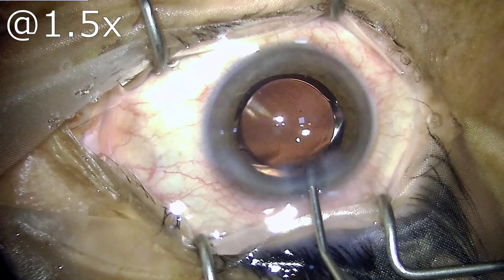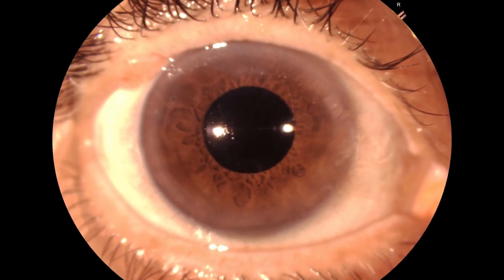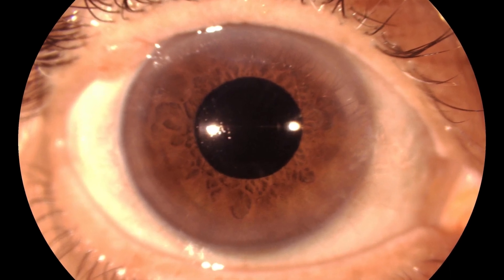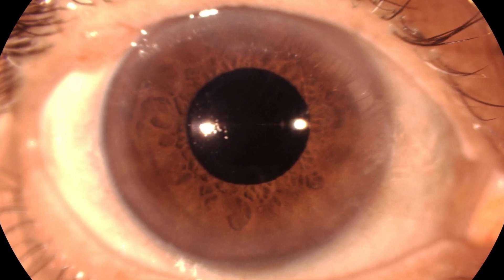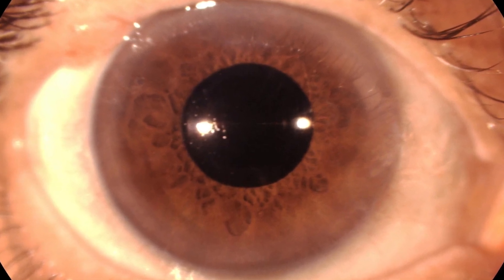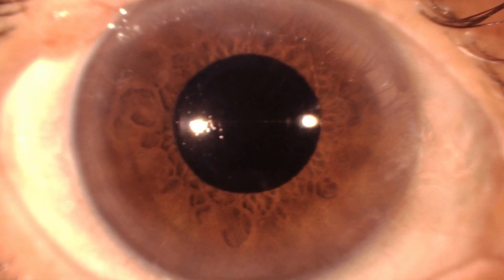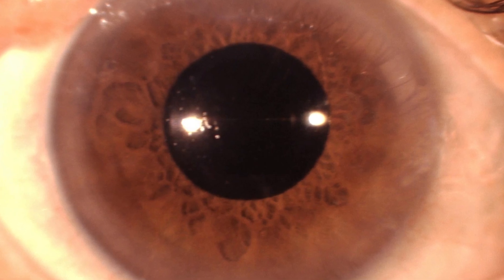Now to see the day one picture. This is the day one picture of this patient and we can easily appreciate the clarity of the cornea. The patient's vision was 6/9 unaided with N8 near vision unaided. This is the kind of result which we want our patients to have. Thank you.